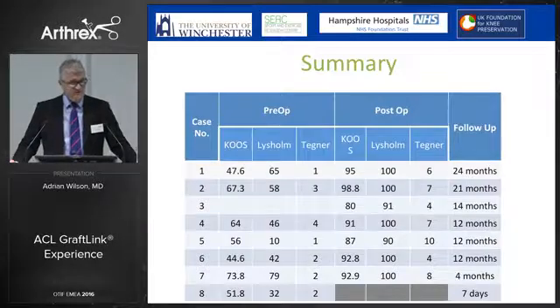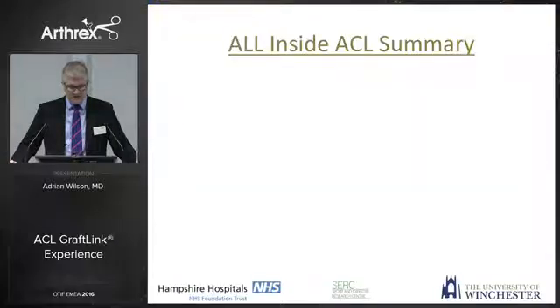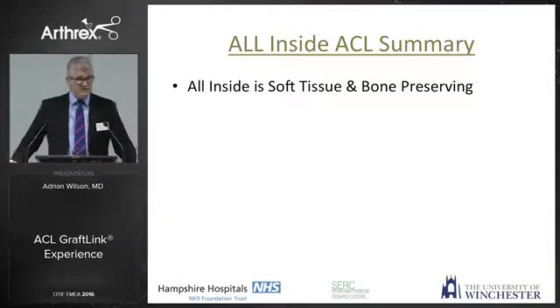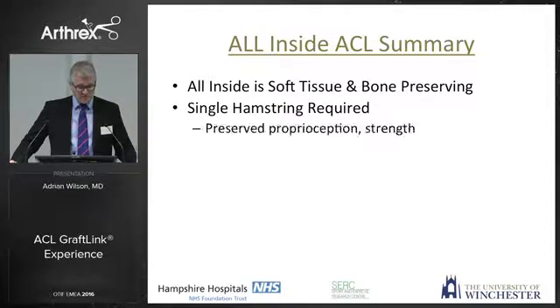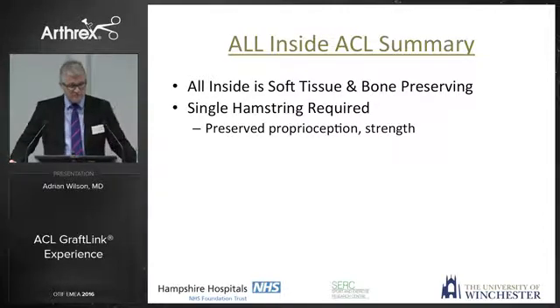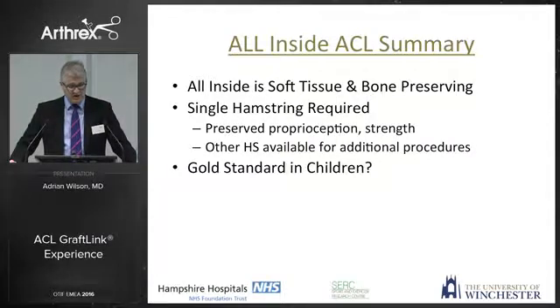So we've been following up these small children and looking at their scores. We've had no failures, and I think this is a very good technique for the skeletally immature in terms of repair. So just to summarise about All-Inside ACL, it's soft tissue and bone preserving. Use a single hamstring. We can preserve the other hamstring for proprioception and strength, but also use it for additional procedures. I think this should be the gold standard in children personally.